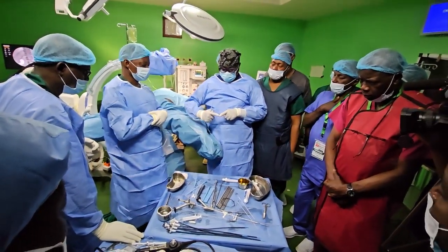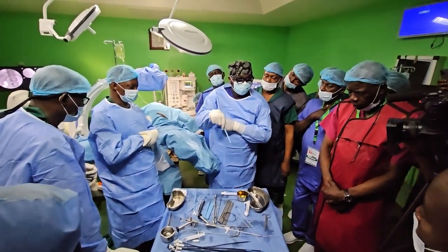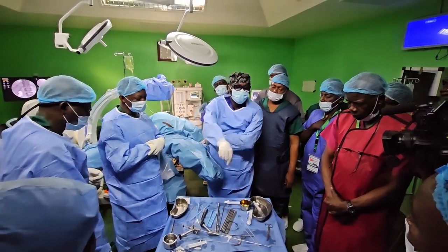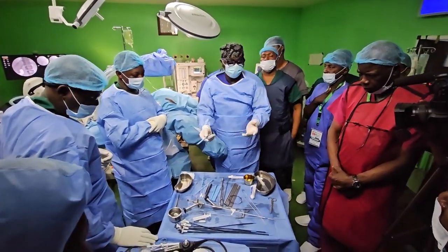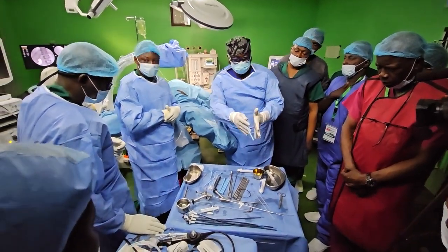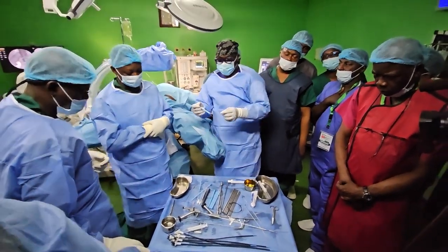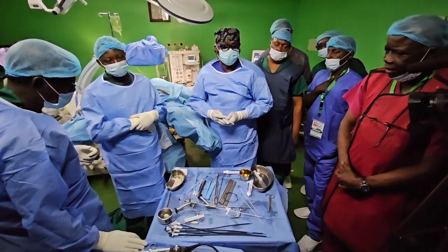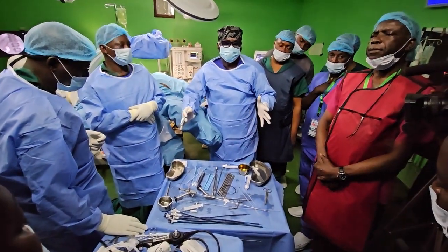Because once you inflate the balloon, the dilatation catheter has a wide junction, so you won't be able to load your sheath again. It has to be preloaded before you put it in. That's a very critical point. If you miss it, you are going to waste that balloon, and it will not work. And you might even bleed, because you have inflated the balloon inside the kidney and dilated it. You now have to remove it, put this back, go back in, and all of that will make your procedure clumsy. So those are basically the dilatation techniques.